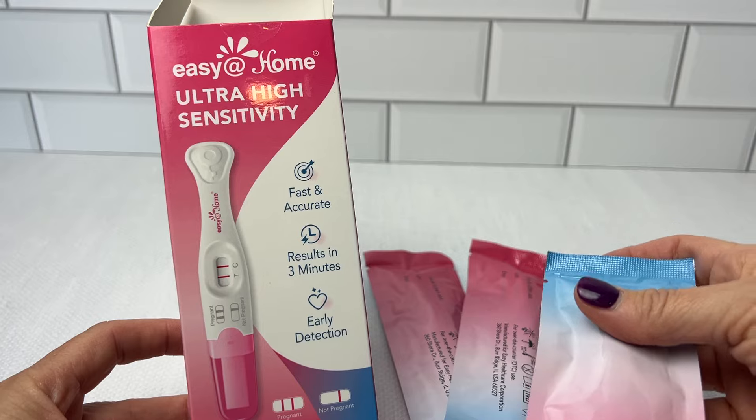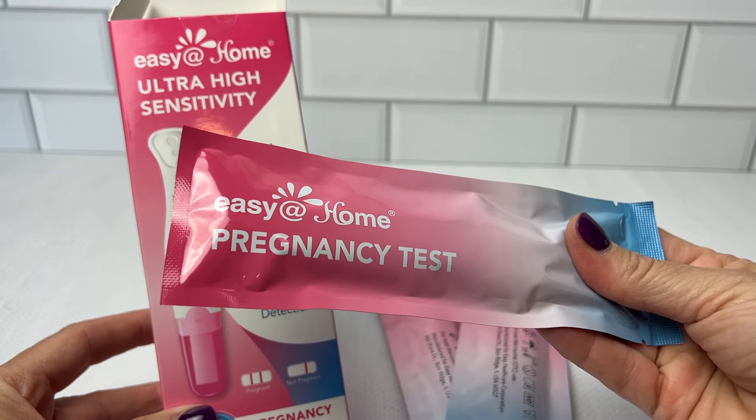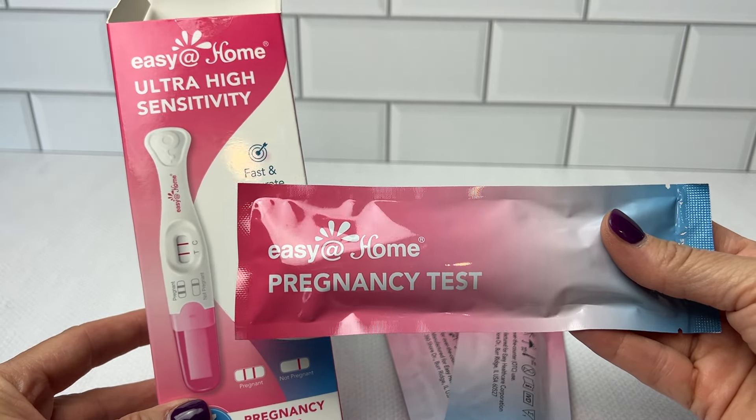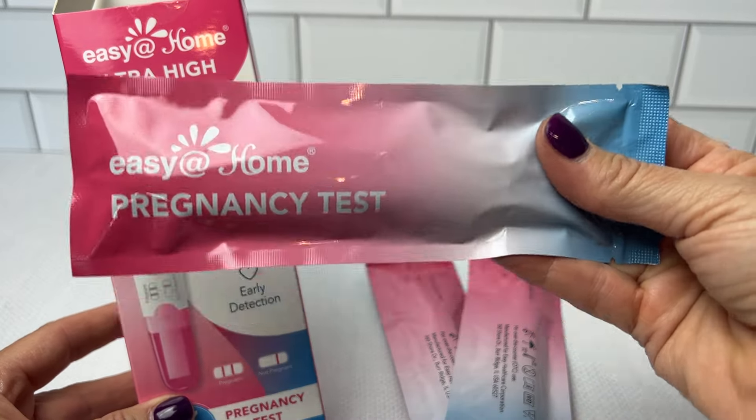I believe that these ultra-high sensitivity pregnancy tests are a must-have for anybody looking for accuracy, ease of use, and affordability in the home testing experience. I highly recommend these.